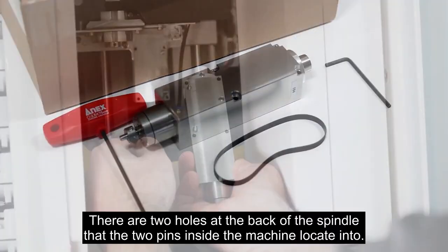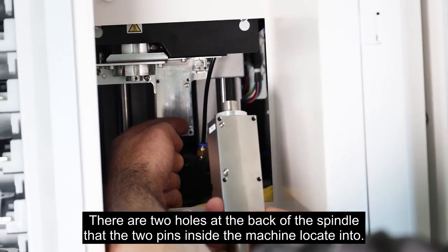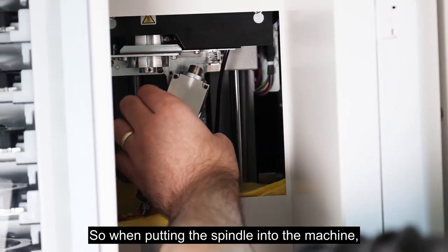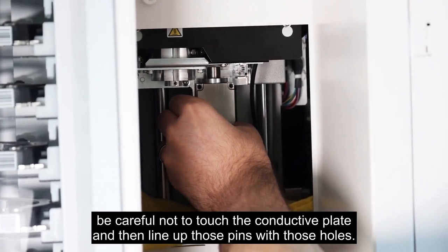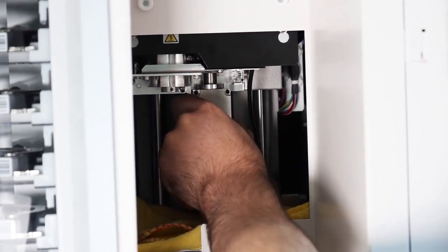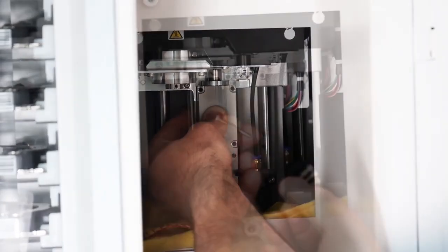of the spindle. There are 2 holes at the back of the spindle that the 2 pins inside the machine locate into. So when putting the spindle into the machine, be careful not to touch the conductive plate and then line up those pins with those holes. Push the spindle all the way to the back to make sure it's fully seated.